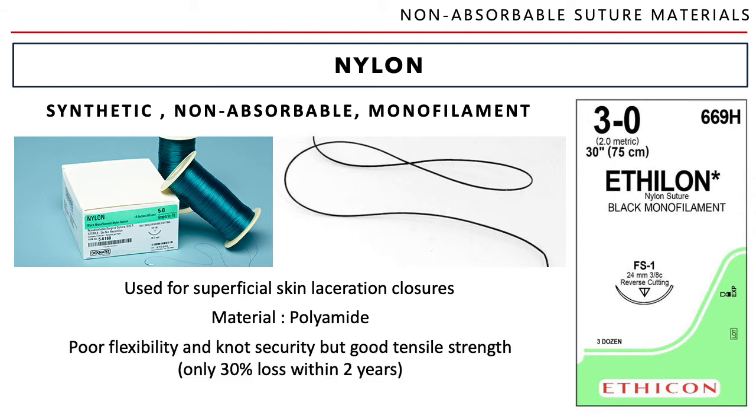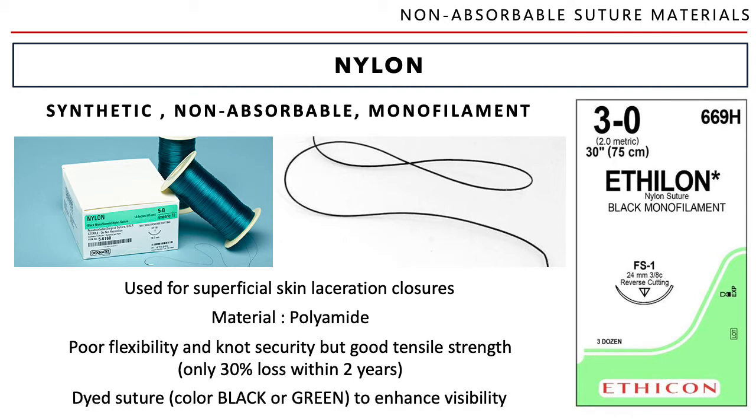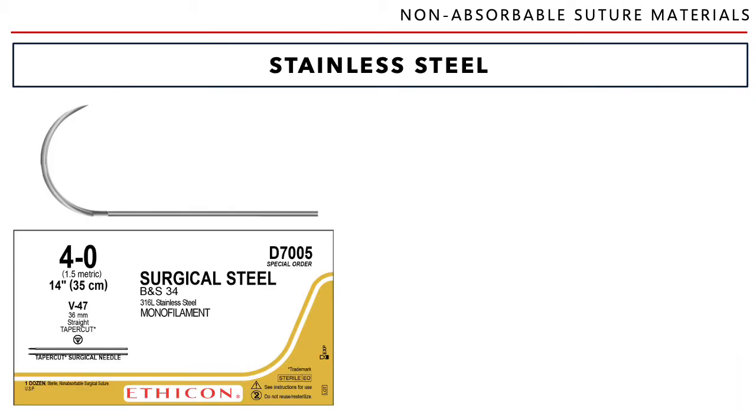Okay. Material, polyamide. Poor flexibility and knot security, but it has good tensile strength. It is dyed suture, either black or green. Okay, ganun lang siya.